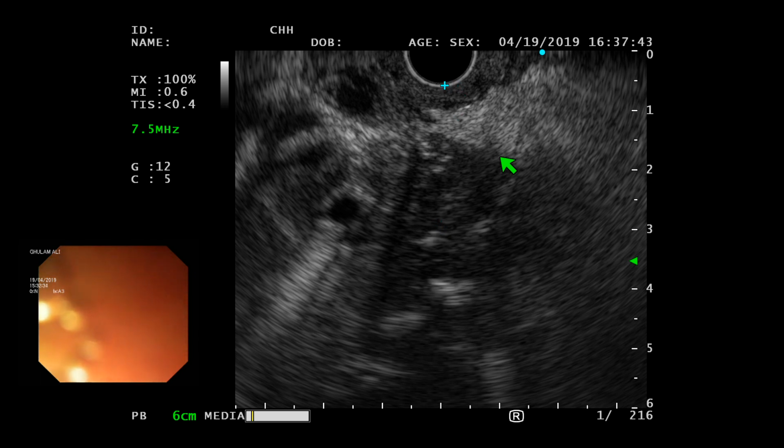I didn't hear that. Anybody? So 4 millimeter? So duodenum is the thinnest part. Duodenum and cecum, that's the thinnest part in the GI tract. And usually it's between 2 and 3 millimeter. Okay. So 4 millimeter is towards the other side.